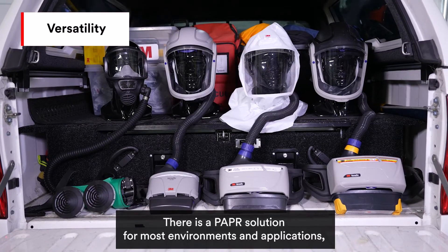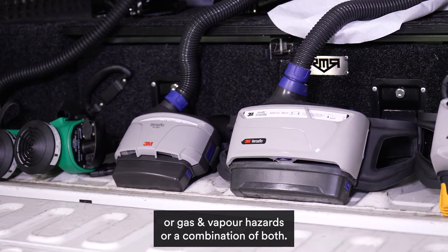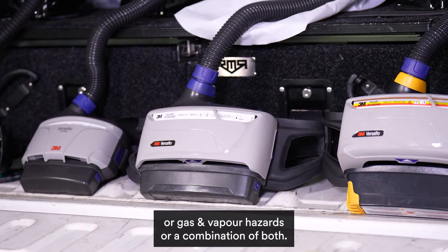There is a PAPR solution for most environments and applications. There are filters to protect workers from particulate or gas and vapour hazards, or a combination of both.